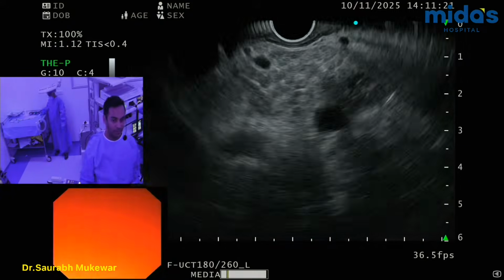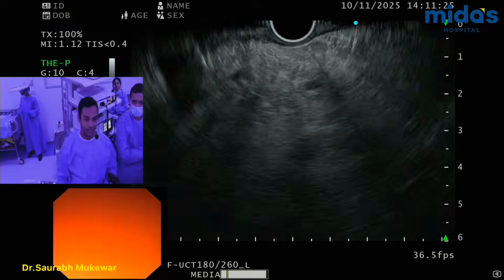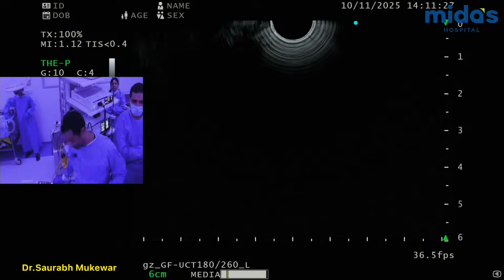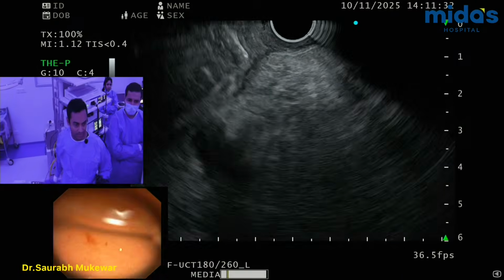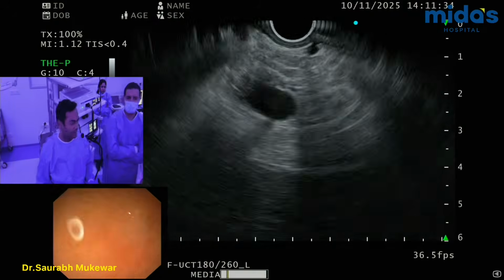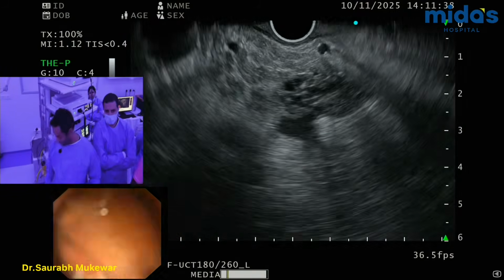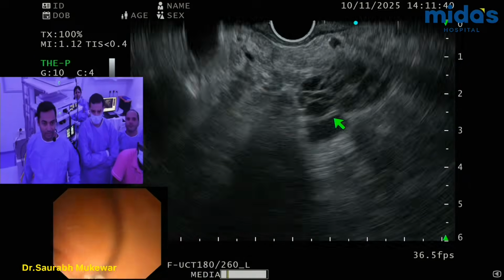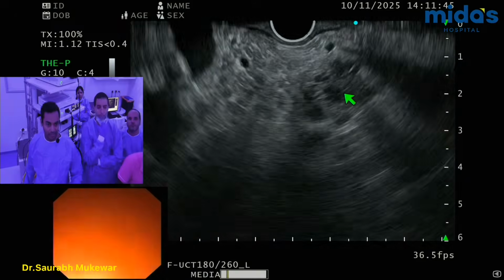So we have these cases. Got it. Yeah, it's cool. All right. So there's a patient with pancreatic cystic lesion on the scan in head of pancreas. So as I explained, I think it's partly recorded as well. What you're looking at is obviously what we're discussing. This is the lesion in the head of pancreas, and this is the cystic lesion. This is the pancreatic parenchyma.